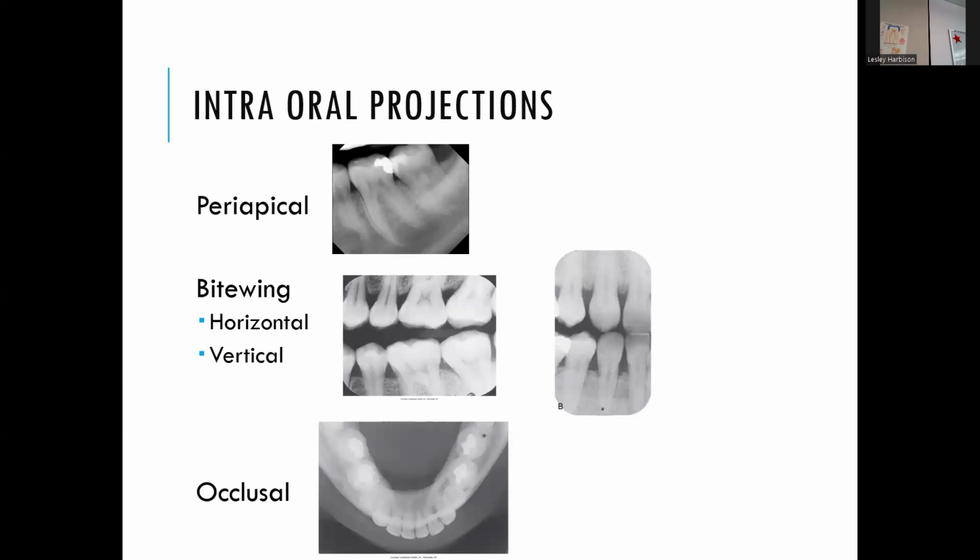For the occlusal, start right here, the last one is an X-ray. Yeah, that's how it's supposed to look.